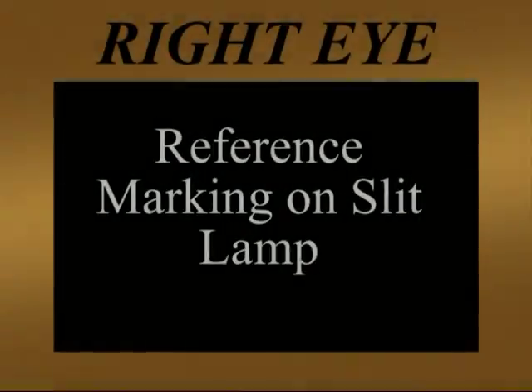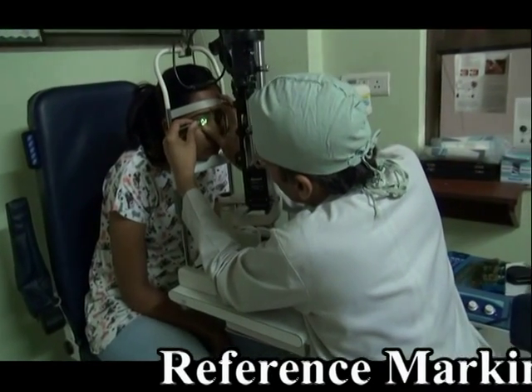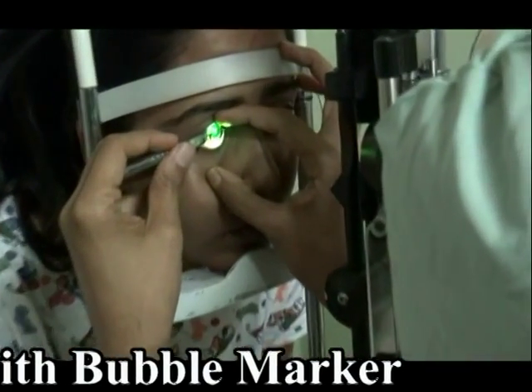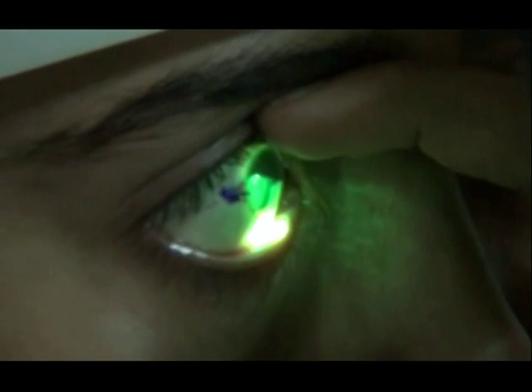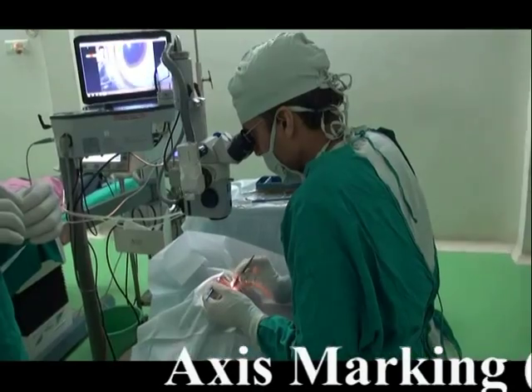After planning the surgery and obtaining the right size and power of the IPCL — which is custom made according to each patient's individual eye measurements — the first step for a toric IPCL implantation before taking the patient into the OR is to do reference marking on the slit lamp. This is the same as for a toric intraocular lens. Here the reference marking is being done on the slit lamp preoperatively.